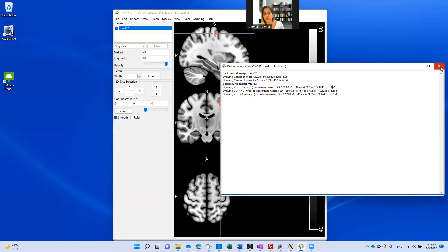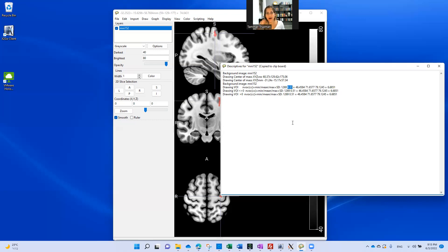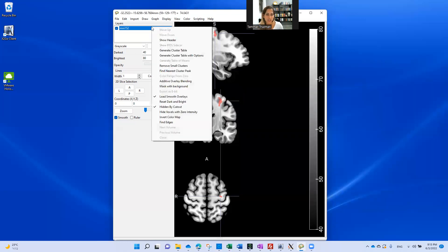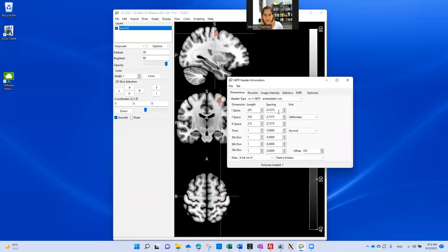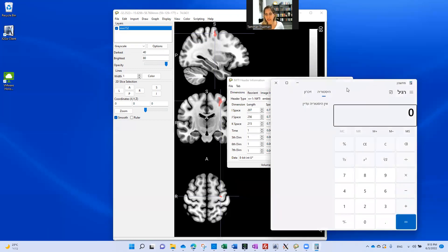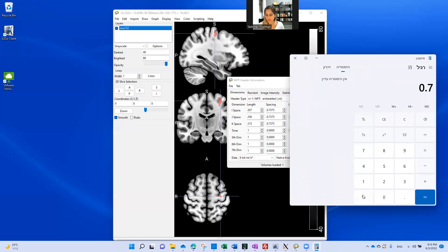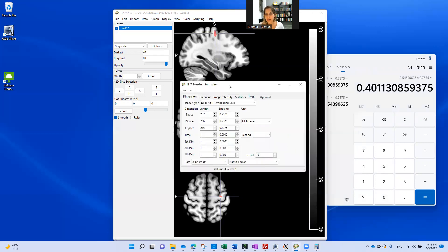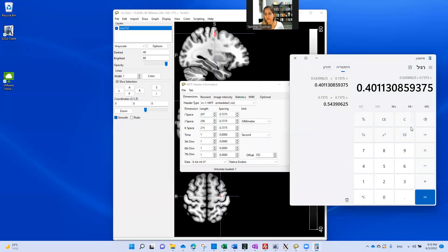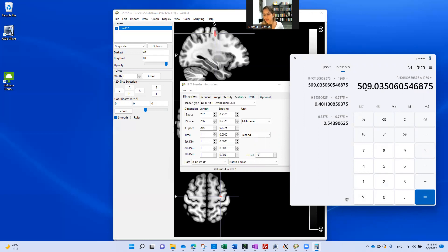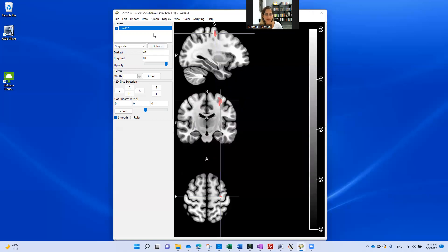If I want to convert the volume to millimeters, this number cubic centimeters taking to millimeters, I have to multiply this number by 1000, because it's 10 to the power of three, which will give me the conversion between centimeters and millimeters. I can also get this information from the image header. Going here, the spacing of each single voxel. I multiply the spacing of each dimension I, J, K, equivalent to X, Y, Z. This is the volume in millimeters of a single voxel. If I multiply this by the number of voxels, which was 1,269, I get pretty much the same number. So 509 volume millimeter of my VOI.